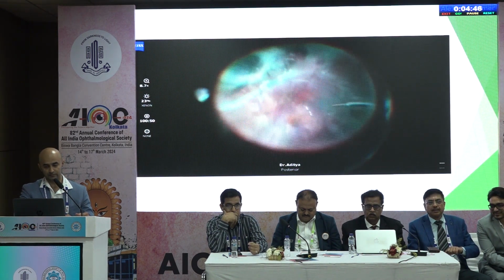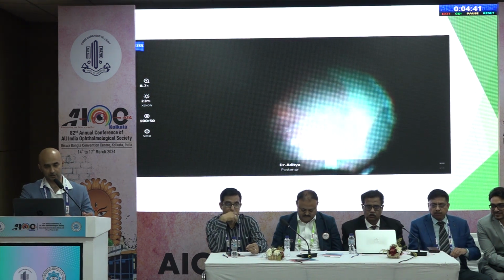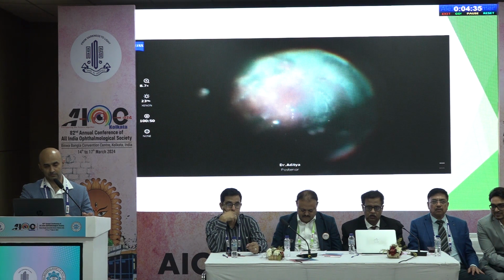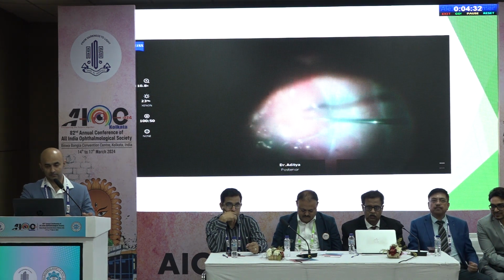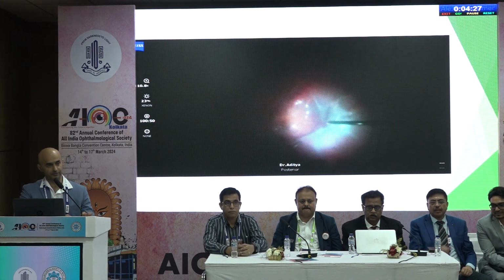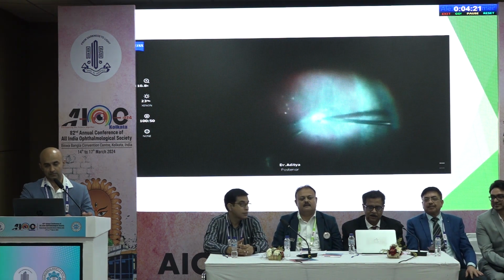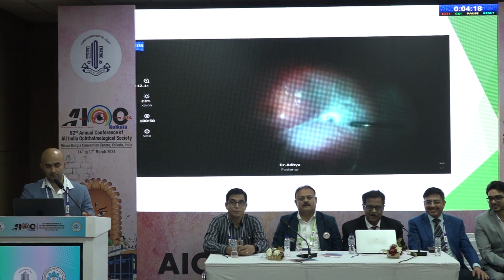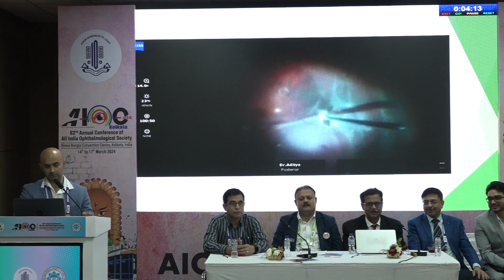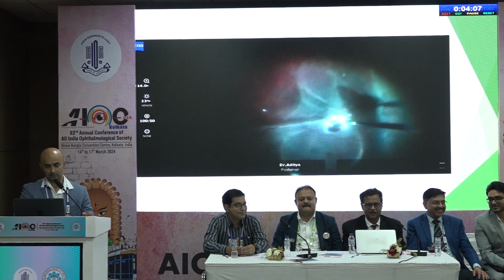You can see there are extensive proliferative subretinal bands too. So as I put in PFCL, some more silicone oil escapes out from the retinectomy site, which was then removed. And then I reduced the height of the PFCL bubble because now there is a subretinal band which I want to remove. So I did a small drainage retinotomy, and silicone oil and a subretinal band was removed from the subretinal space.